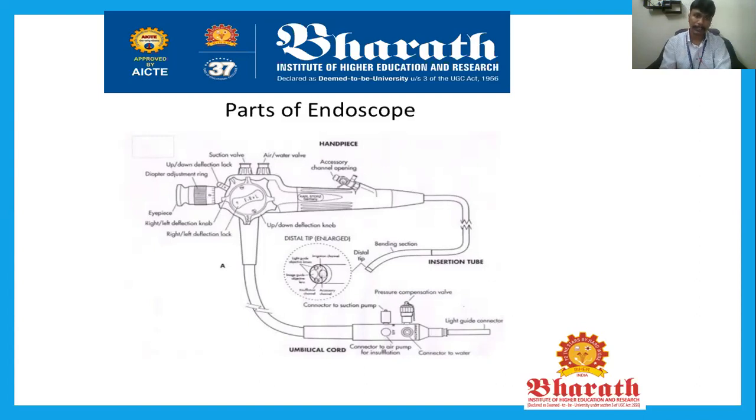It will be transmitted to the computer, and the computer will capture the data, and doctors will use that image for analysis. So these are the parts of the endoscope which is used to capture the internal architecture of the human body.